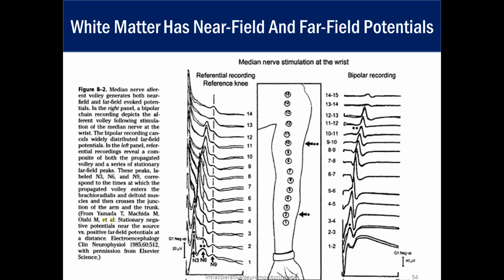You're going to pick up a lot of these vertebral muscles, or these spinal muscles, as those have a compound muscle action potential. We pick up that activity. So when you have a bipolar D-wave, you typically need fewer averages, but if you're doing a referential D-wave, then you typically need more just to average out the noise.